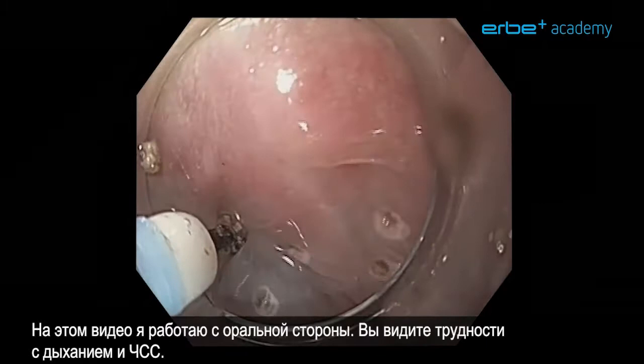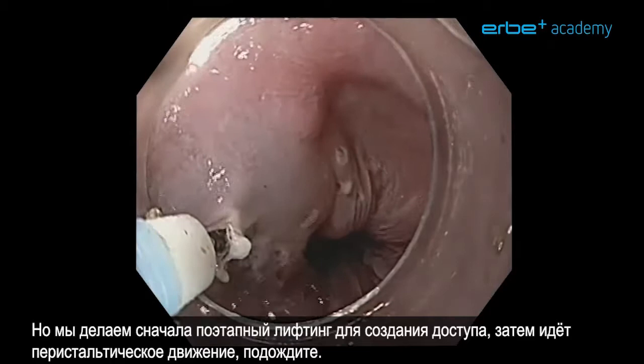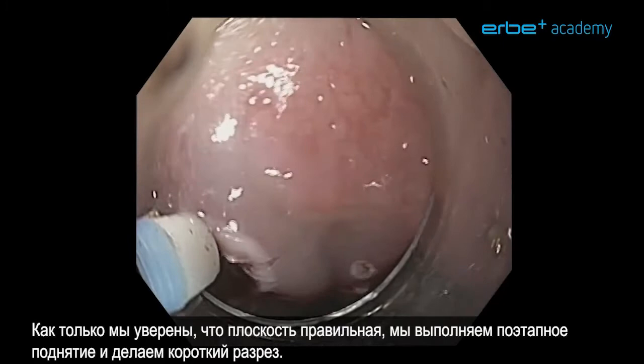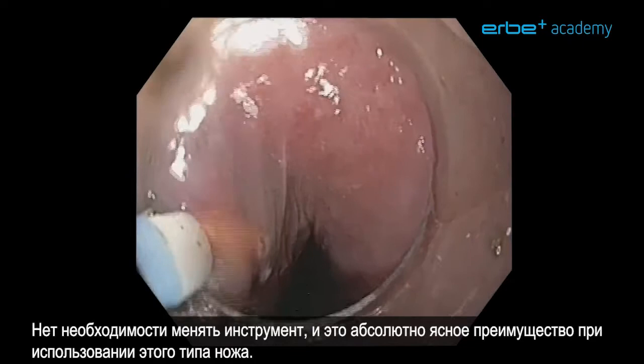In this video I am working on the oral side to demonstrate the difficulty with breathing and heart rate. We do a stepwise lifting first to get access. When there is a peristaltic move, just wait and first make sure that your knife is in the right submucosal plane before you do anything else. Once we are sure we are in the right plane, we do a stepwise lift and make a short cut. There is no need to lift the entire lesion — we do this stepwise.